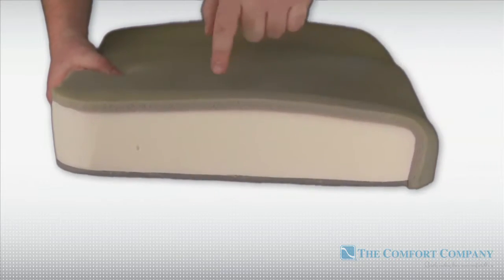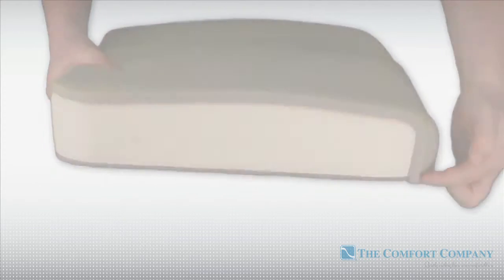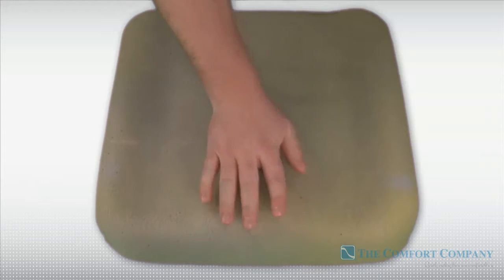A soft foam topper waterfalls over the front, adding comfort and reducing high pressure areas. The Ascent uses an anti-thrust shelf combined with lateral supports and a medial thigh separator to promote postural alignment.